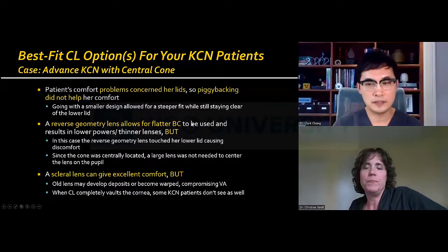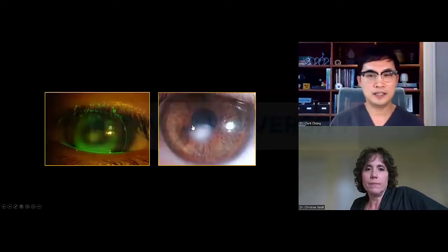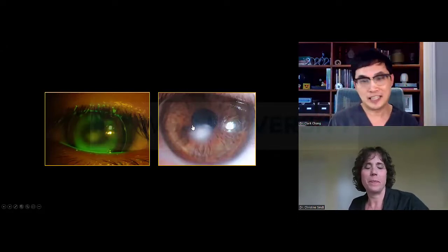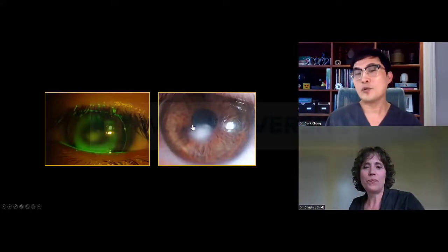Yeah, absolutely, completely agree. So let's not go backwards here. Why did we talk about watching out for the sodium fluorescein pattern? In this case it may actually not lead to where you think this is going. So corneal GP, right?